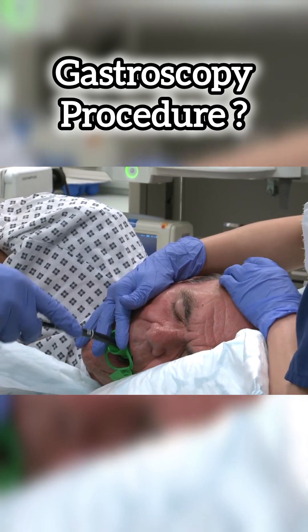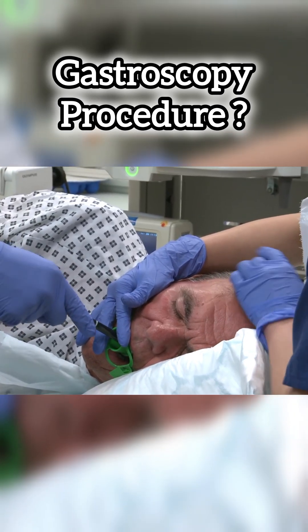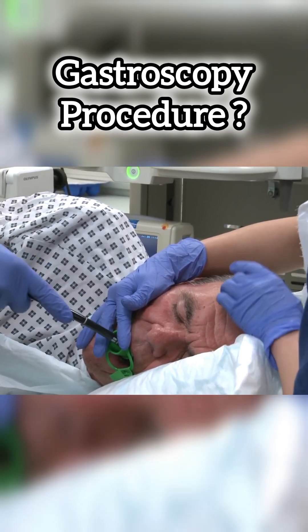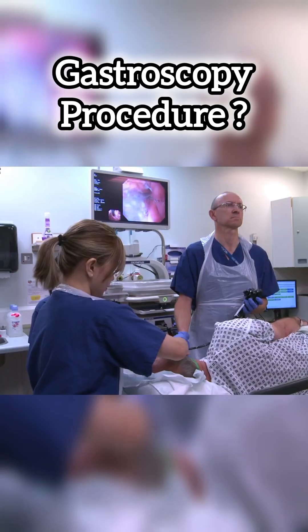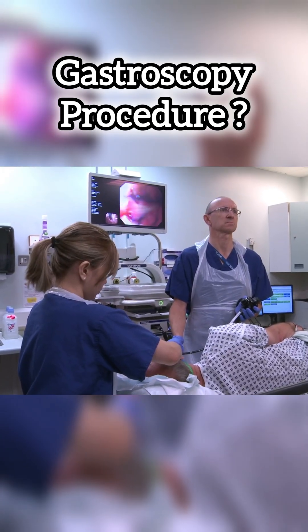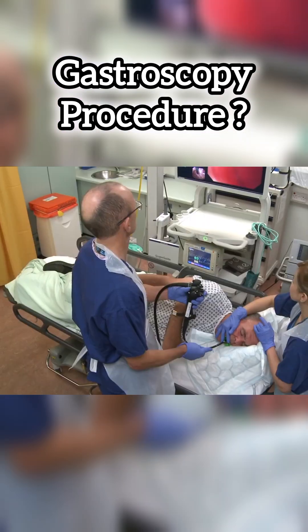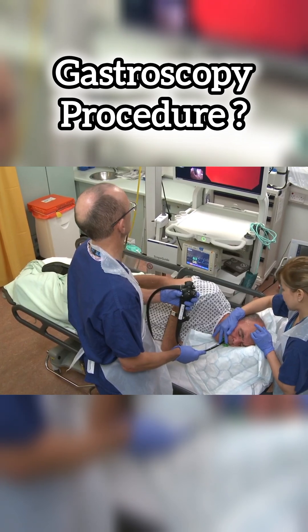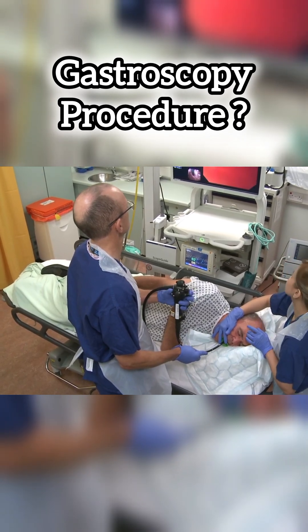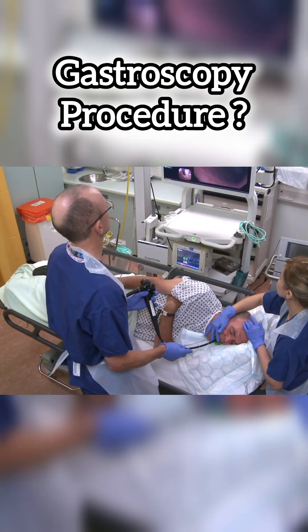You may experience some discomfort from time to time during the test, but we will keep this to an absolute minimum. The aim is to get a clear view of the lining of your esophagus, stomach and duodenum. This will help us to diagnose your symptoms or check any condition that you have had diagnosed in the past.